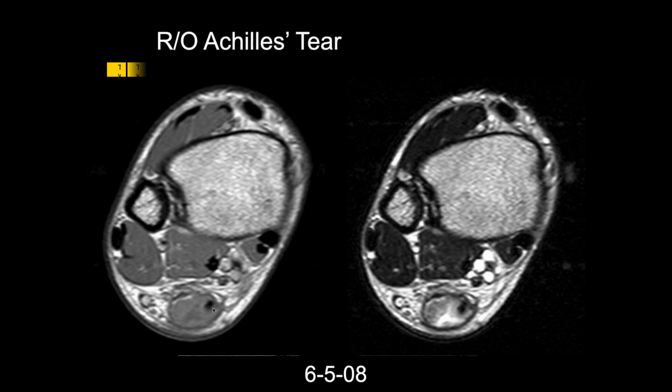That's the plantaris tendon. Okay. The Achilles and plantaris there. And the plantaris is much, much longer, and so it can give a little bit more. It's a small tendon, but as I was talking earlier, you can really stretch that tendon like cigarette paper, and it can go all the way around the Achilles tendon.